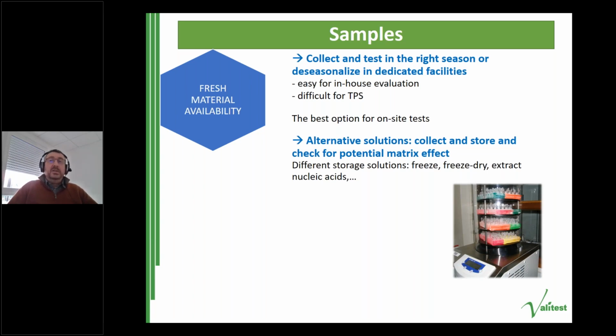Otherwise, you need to organize alternative solutions, I mean to collect and store and check for potential matrix effect. You have different storage solutions. You can freeze dry, or extract nucleic acids.